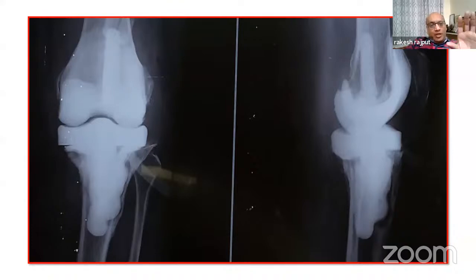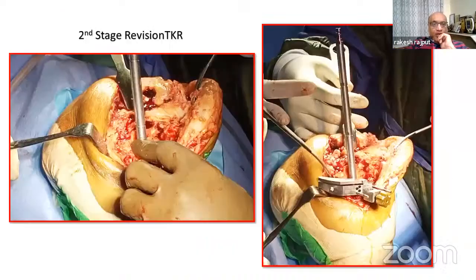So here we are now about 2 months' time, but the patient in this case is very desperate to get a second stage done. So here we sort of see this point still here. So we go in, we start revising our exposure. We realize that a lot of our tibial tuberosity is now actually missing. But there was a small fiber of attachment of the patellar tendon just on the lateral aspect. So we went ahead, did all our preparations.